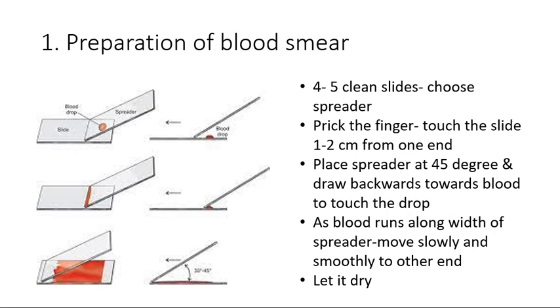Okay, then among these 4 to 5 slides you have to select one spreader. Okay, what is this spreader? Spreader should be having the same slide with very smooth surface. Okay, spreader. Then prick the finger and touch the slide.